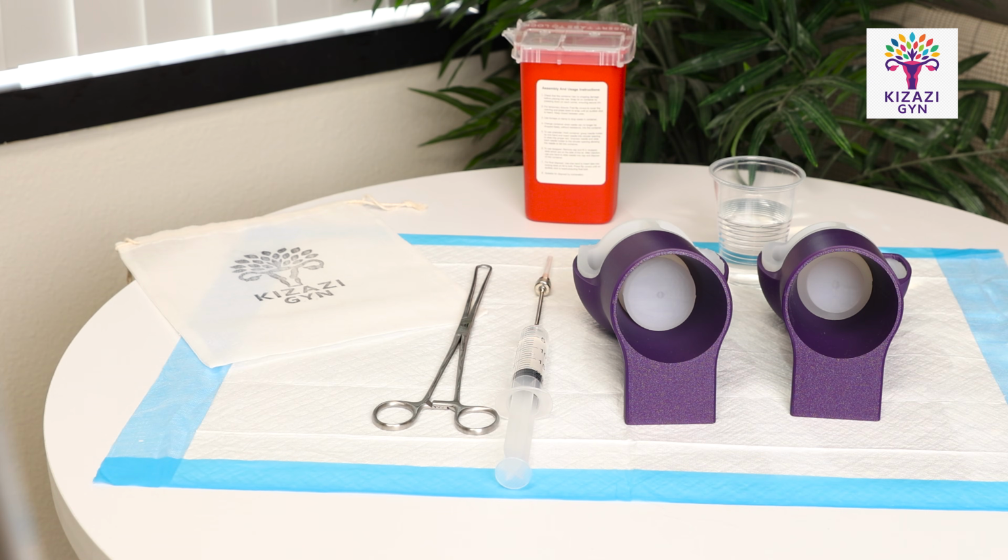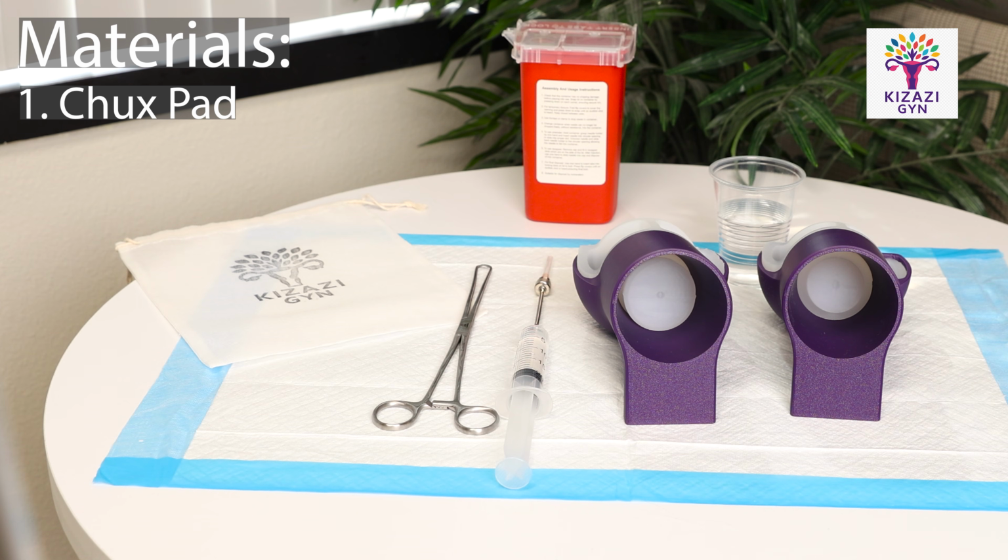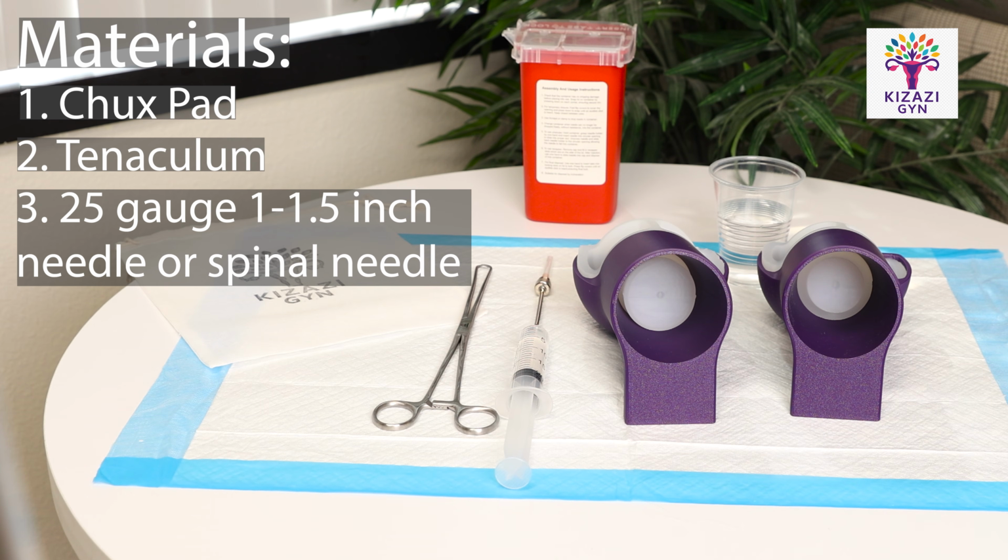Let's start by discussing the materials that you are going to need for your training. Number 1, a Chucks pad. This simulation does use water and it can splash about, so I think that is helpful for you. Number 2, a tenaculum. Number 3, your choice of a needle, either a 1 to 1.5 inch 25 gauge needle or a spinal needle. In this simulation, I am using a 1 inch 25 gauge needle.